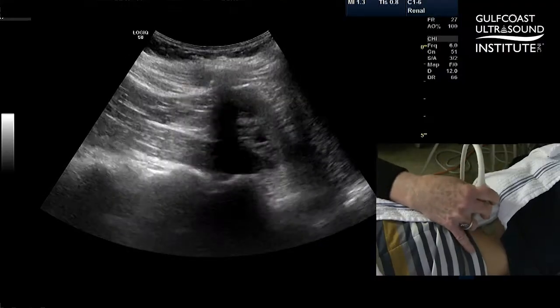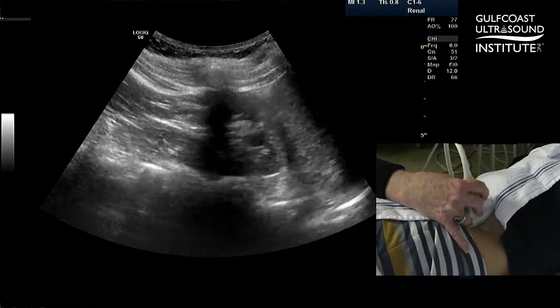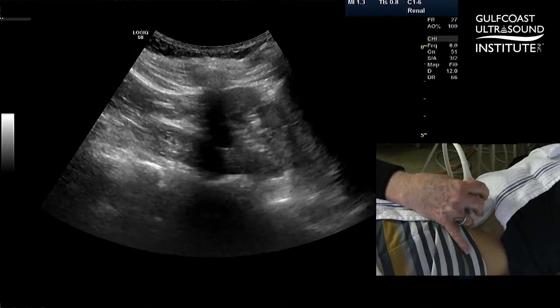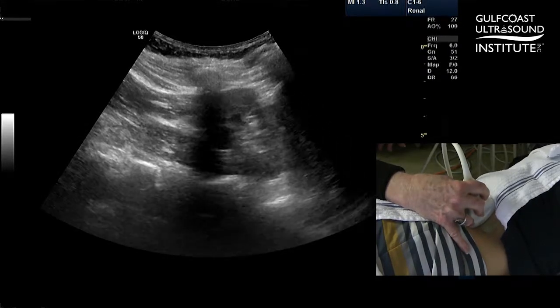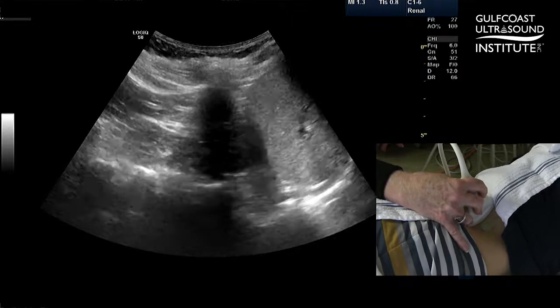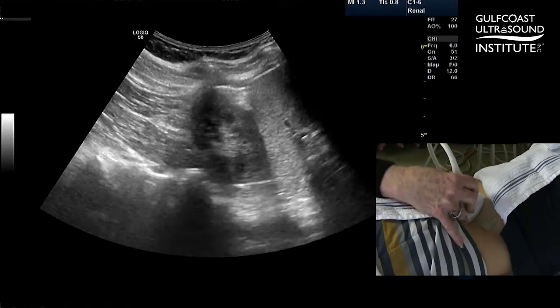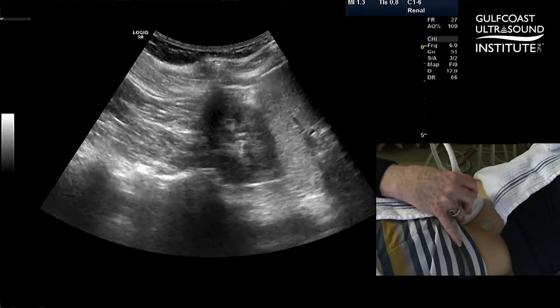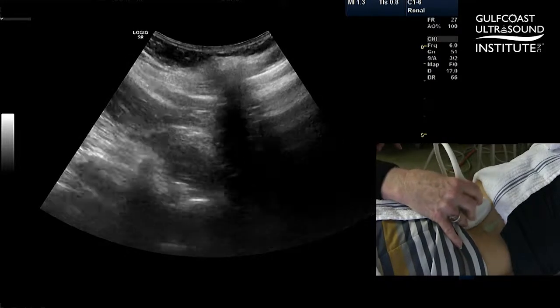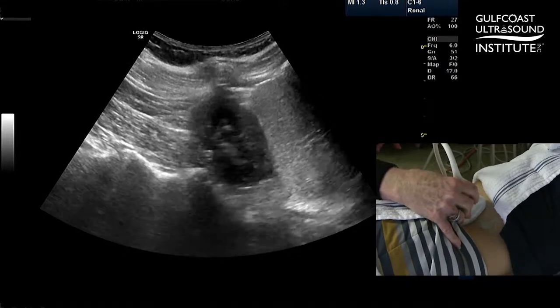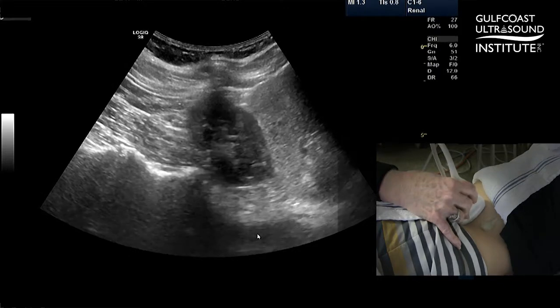I'm looking for a window where I can see the kidney and the aorta. I'm going to ask our model to take in a deep breath and hold it. That's going to expand the ribs and allow me to get a bit of a shadow. The aorta is deep to my scan and then the kidney.